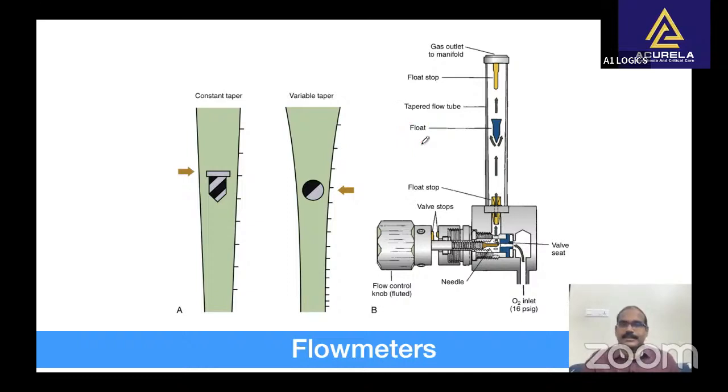Gas entering the side tube pushes the bobbin up in proportion to the gas flow. The bobbin floats and rotates inside the side tube without touching the sides, giving an accurate indication of the gas flow. The side tube is made leak proof at the top and bottom of the flow meter block by O-rings, neoprene sockets or washers.